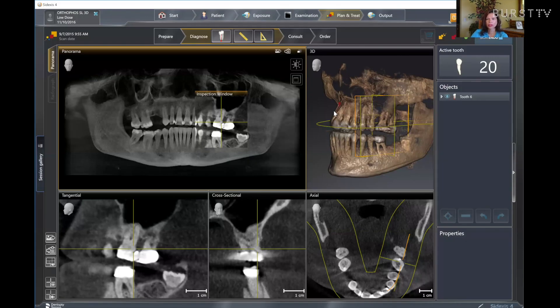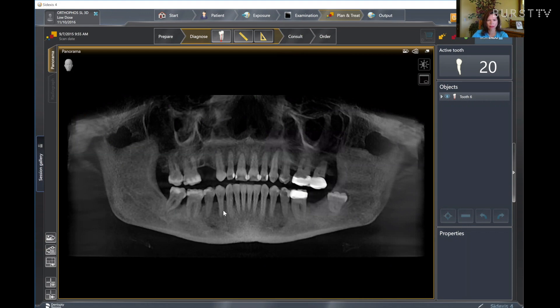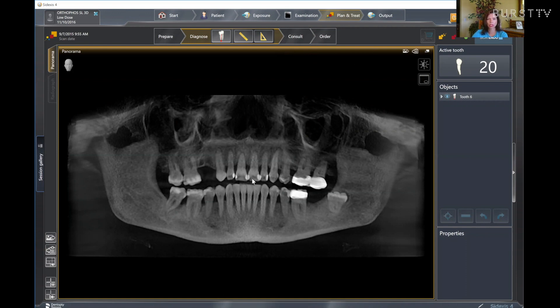Another way to use 3D imaging is for scaling and root planing. Looking at the pan, we can see there's definitely evidence of bone loss. One of the ways we can get a true assessment of how much bone loss there is — since cone beam imaging is a true one-to-one ratio — we can measure it directly. So if the bone loss measures 5.3 millimeters, it is 5.3. It can also give us a better indication for pocket decontamination using lasers for perio treatment. We're going to look at the number 14-15 area and assess how far that bone has deteriorated.